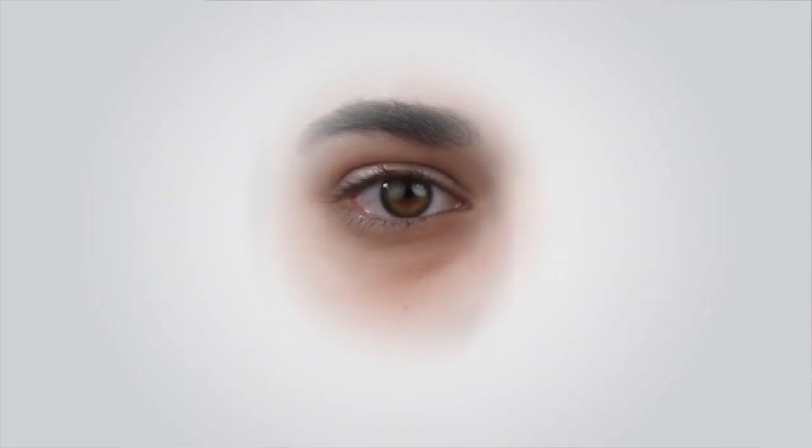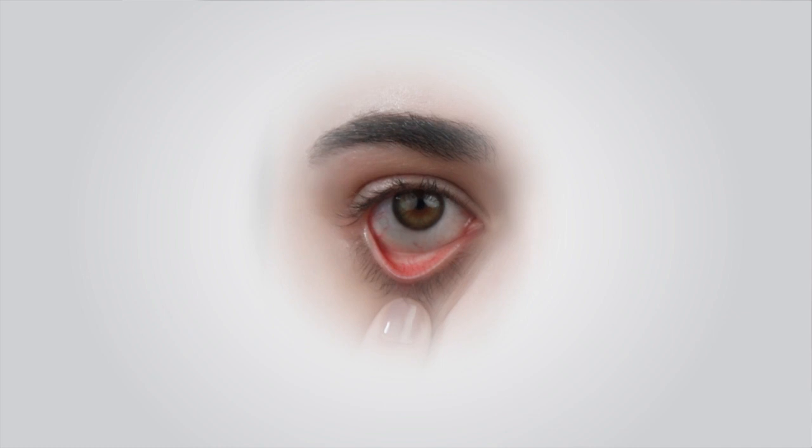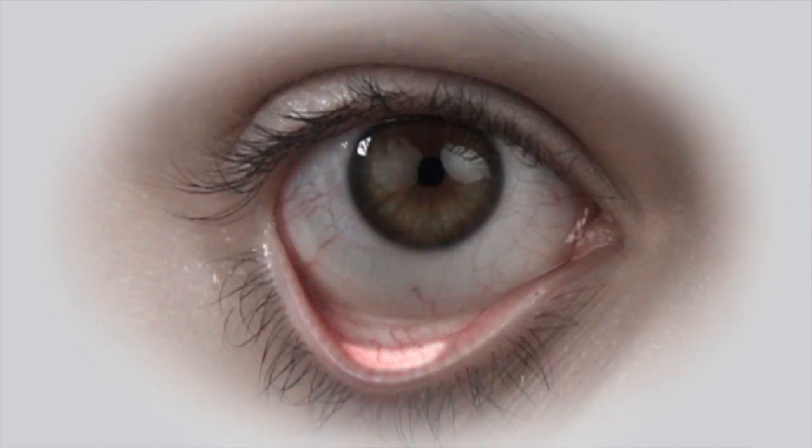Prior to taking a reading, ask the patient to gently squeeze their eyelids shut for 30 to 60 seconds. Hold the patient's lower eyelid down to invert the eyelid and expose the pocket. The highlighted area shows the conjunctiva where the iPen sensors should be placed.